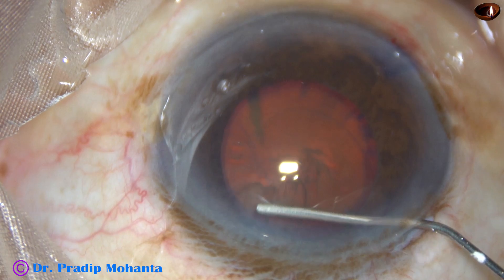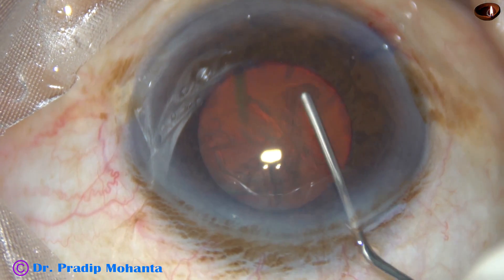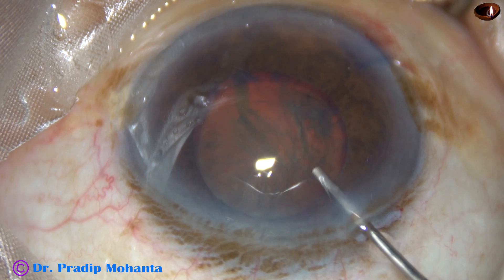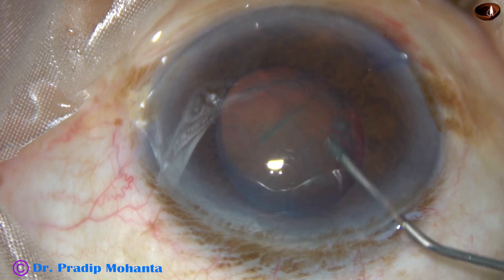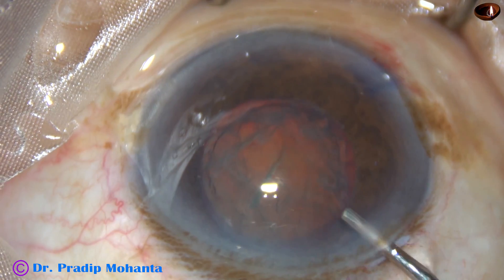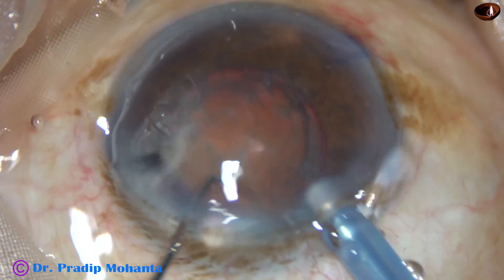Rhexis has been done very gently and now this is hydrodissection. The nucleus is tapped very gently. Hydrodissection has been done at multiple points and now the nucleus is rotating — and every moment I am afraid that the capsular bag should not be seriously damaged.